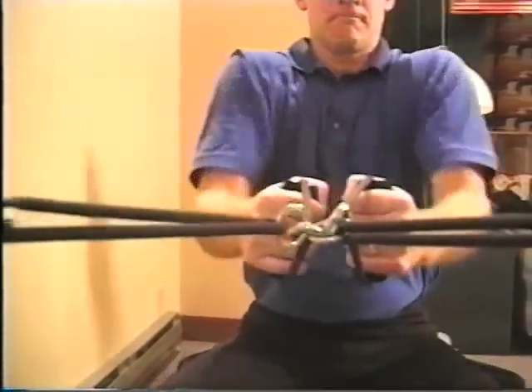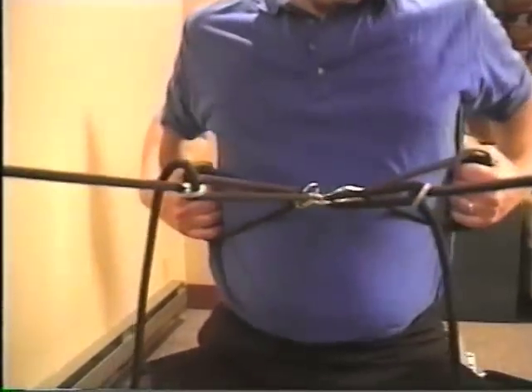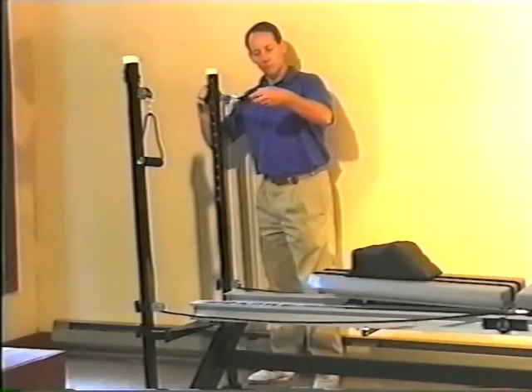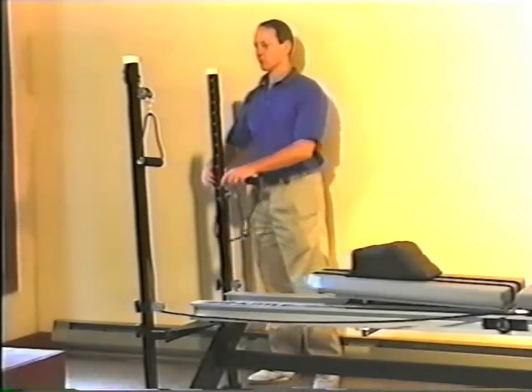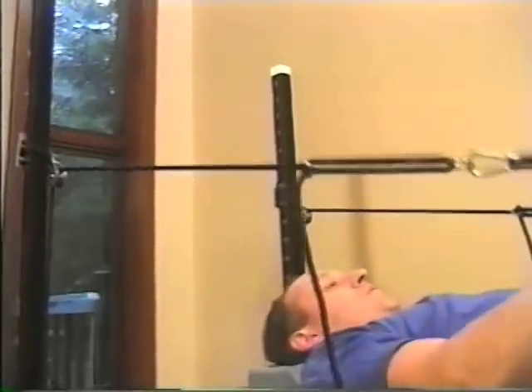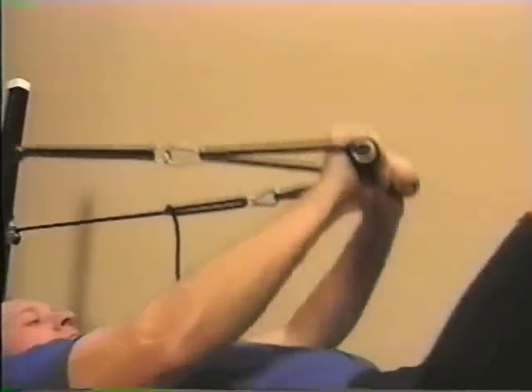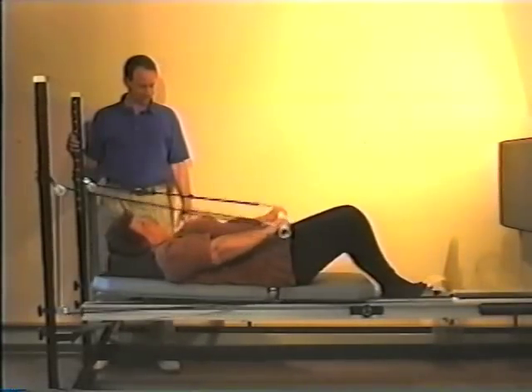With the integration of various accessories, the shuttle's applications can be expanded to the upper extremities, torso, and back. For example, by utilizing the PNF towers, you can control the angle of pull for diagonal PNF patterns for both the upper and lower extremities. Other uses of the towers include upper body strengthening exercises such as lat pulls, seated row, chest press, or almost any other upper body activity you can imagine.